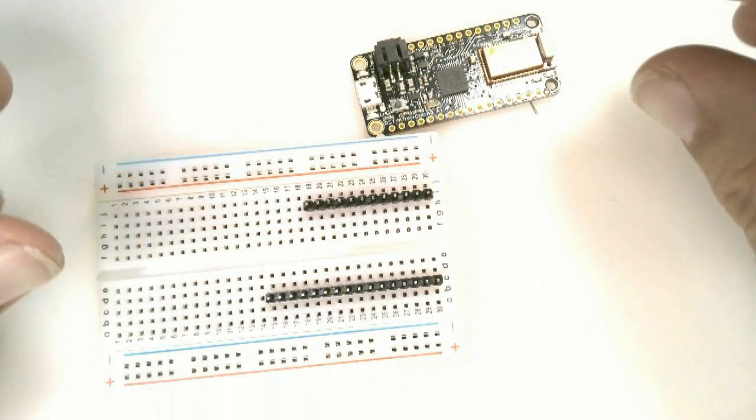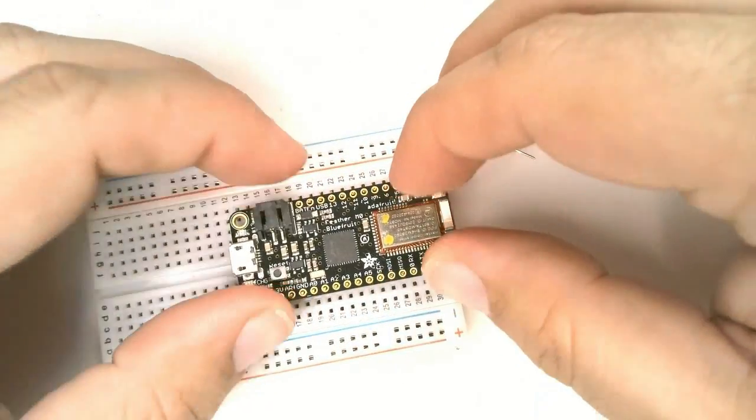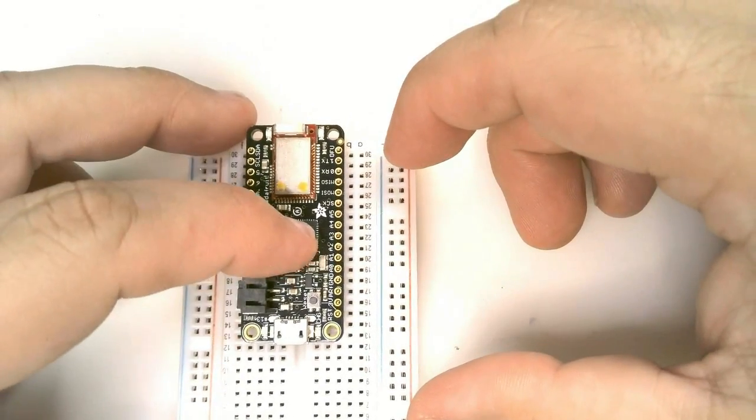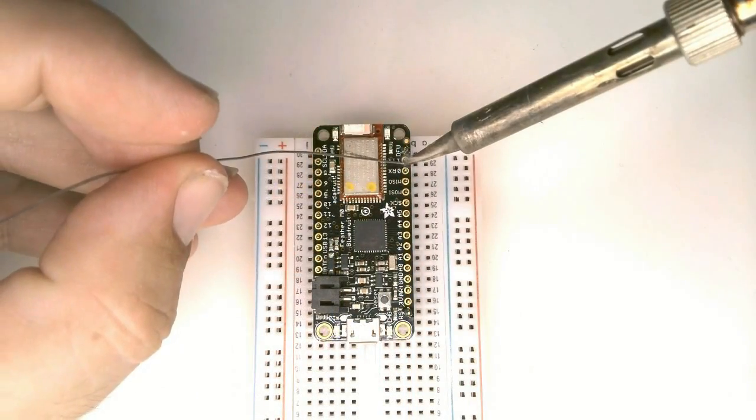Now we're going to solder some header pins onto the Feather M0 BLE. They come in sets of 16, so you'll have to break off 4 of the pins to make a 12-pin header. Insert the pins into a solderless breadboard, and then place the feather over the pins and solder each one.